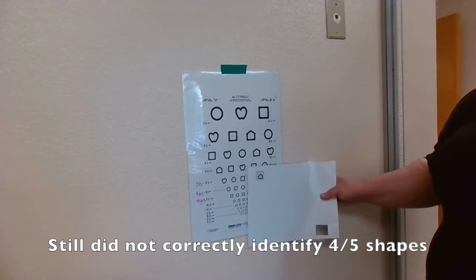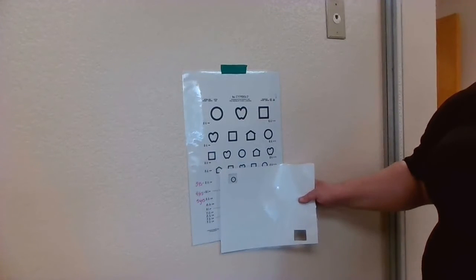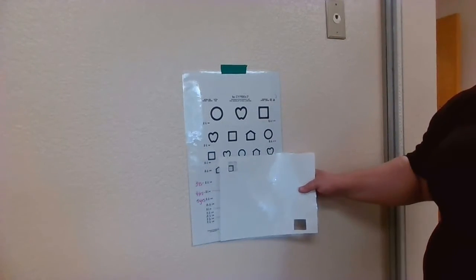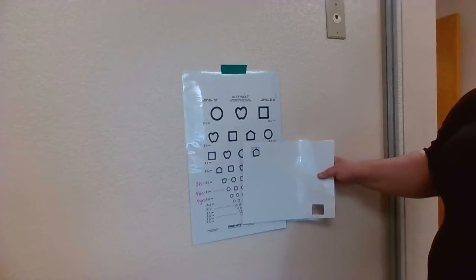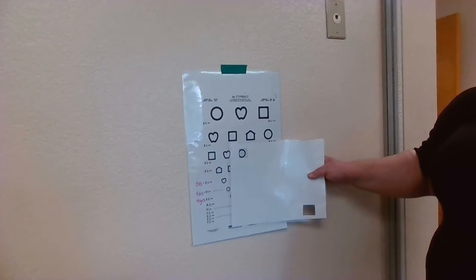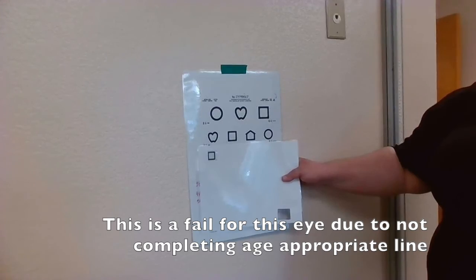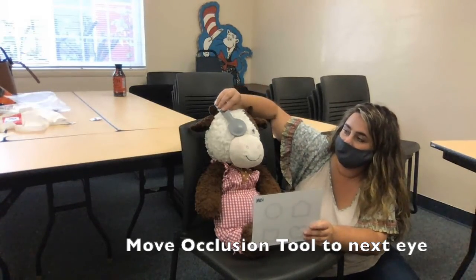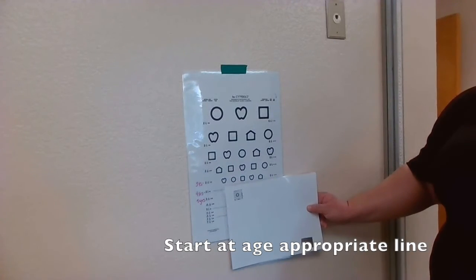In this example, the child continues to not identify 4 out of 5 shapes correctly in the line, so the staff member continues to move up until the child correctly identifies the shapes in that line. From here, we would mark down which line they accurately identified 4 out of 5 shapes and record that along with a failure.